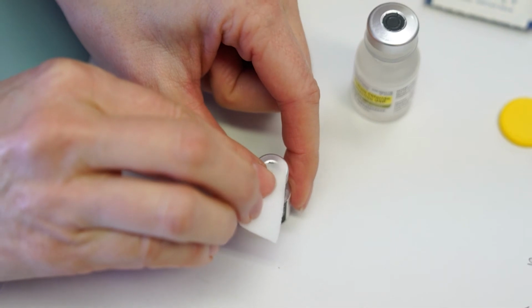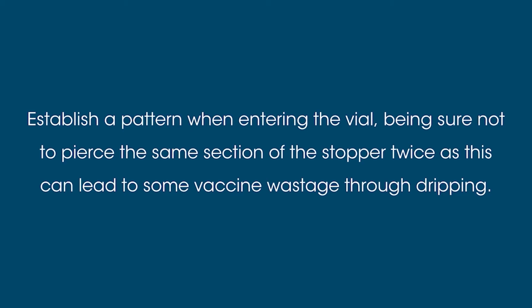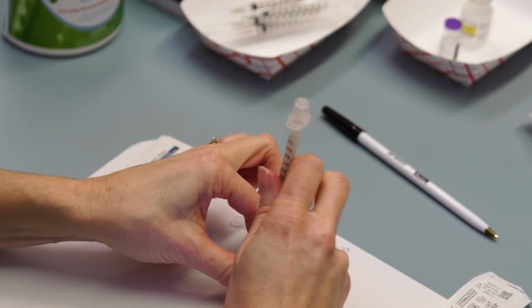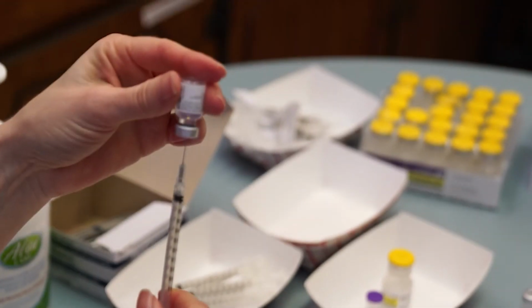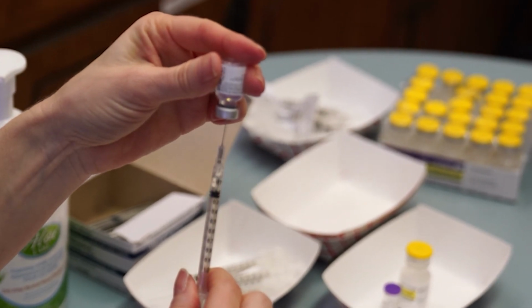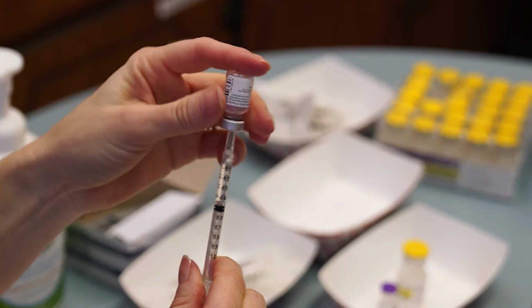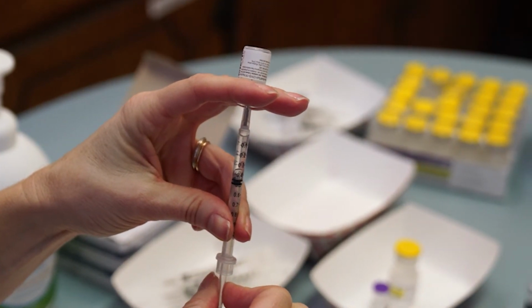Prior to each time you enter the vial, you must wipe the top with an alcohol swab and allow it to dry. Establish a pattern when entering the vial, being sure not to pierce the same section of the stopper twice, as this can lead to some vaccine wastage through dripping. Puncture the vaccine stopper with the vaccine vial on the table. Gently invert and draw up the 0.3 mL dose. Be sure that the bevel of your needle is in the fluid before you start to withdraw. It is also helpful to twist the plunger in your fingertips while you pull back. This decreases the air and helps any tiny bubbles to make their way to the needle tip.